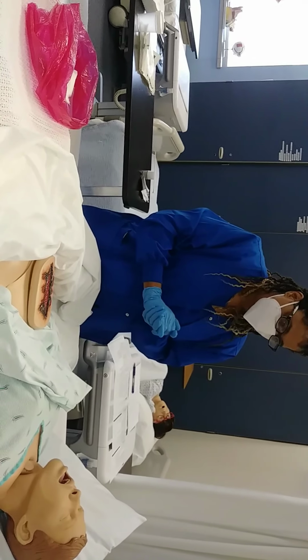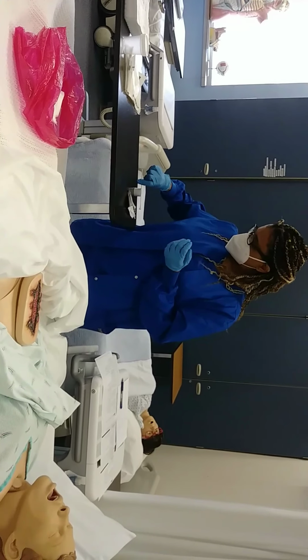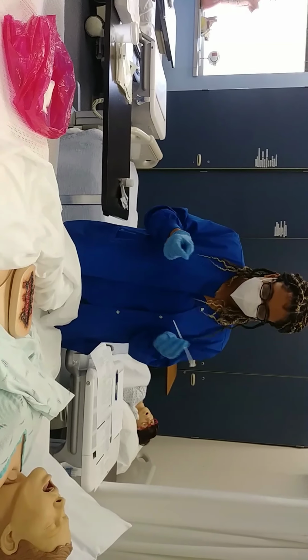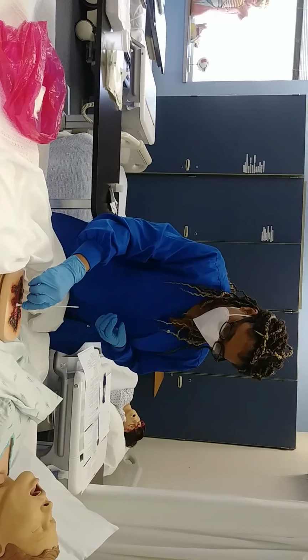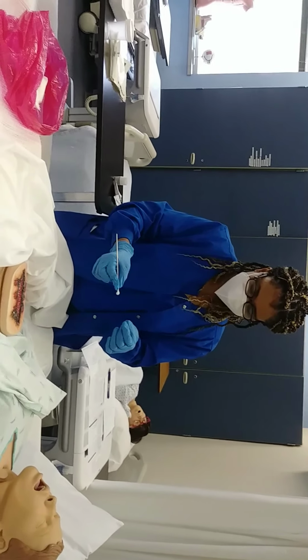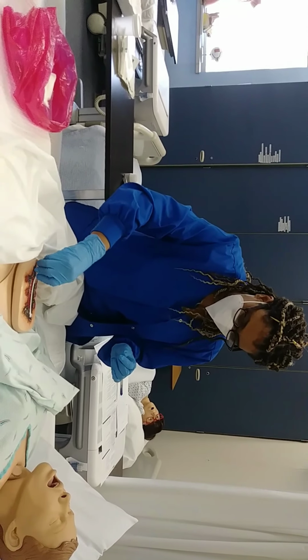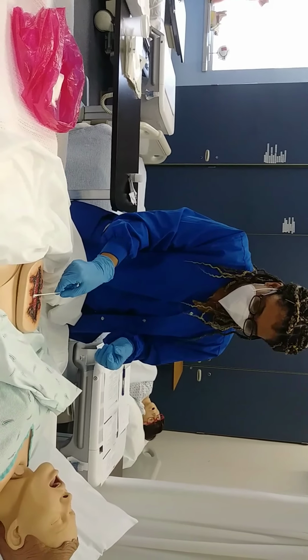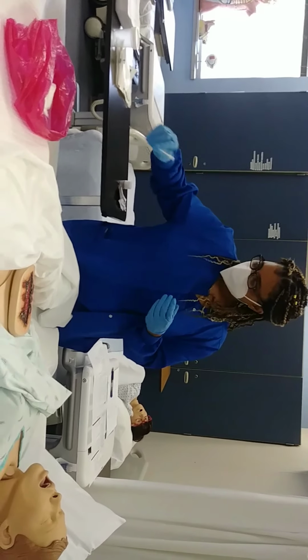But I do need to, at this point, measure the wound bed. So I'm going to remove this from the packet, and I'm simulating that I have a measuring piece that I'll use to measure the depth of the wound. Simulating it, and I've gathered the amount, the depth. Using the same one, I'm going to measure the length, document that in my head, and I'm also going to measure the width. So once I have those measurements, I will dispose of that.